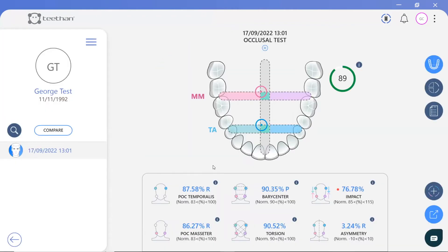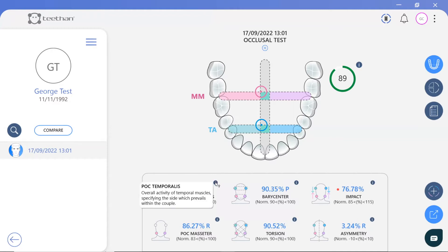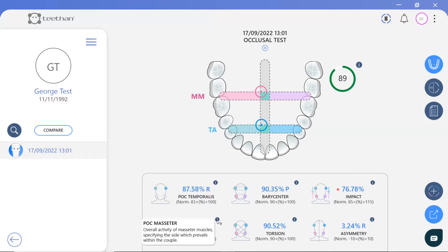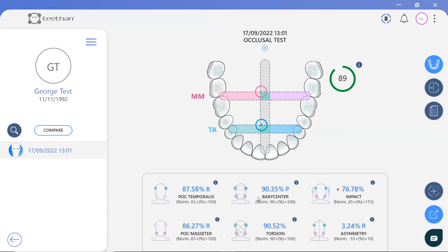Teethan evaluates 5 key values and their related normative ranges. POC stands for Percentage Overlapping Coefficient, which is a similarity measure that calculates the overlap between two datasets. In this case, POC temporalis is the overall activity of the temporalis muscles, specifying which side prevails within the couple between left and right. This measure can also be seen for the masseter muscles as the POC masseter. For this patient, both values are within the normative range, as displayed within the vertical grey zone, but the right side prevails, as indicated by the letter R and the shift of the circle symbols to the right side of the mouth.